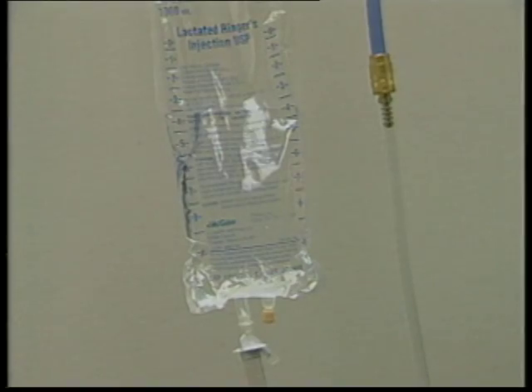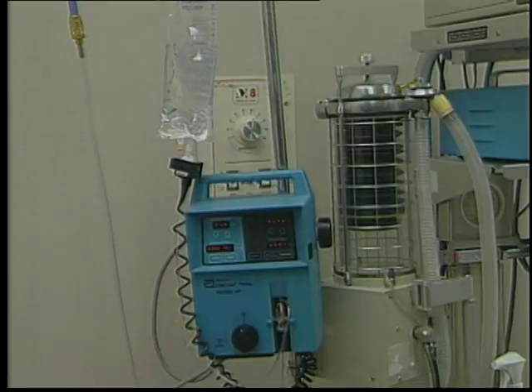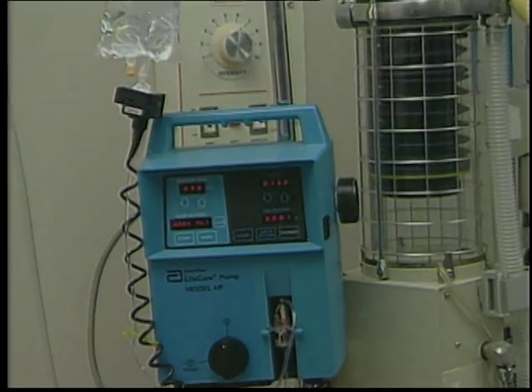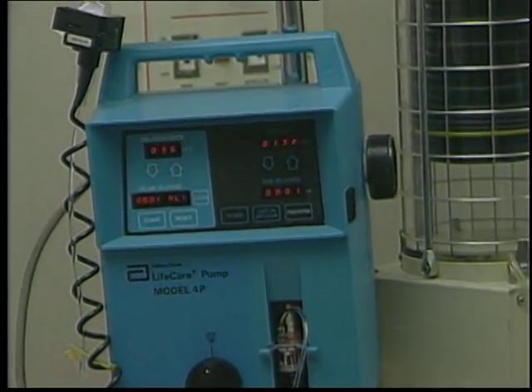Some surgery patients will need to receive fluid therapy during the surgical procedure. Fluids help to support the circulation and serve to replace fluid loss associated with blood loss. The fluid administration rate will be determined by the veterinarian. You should pay attention to the drip rate to assure proper fluid levels are being administered. Fluid pumps regulate this drip rate very accurately and can be programmed to alarm you if this rate is altered.